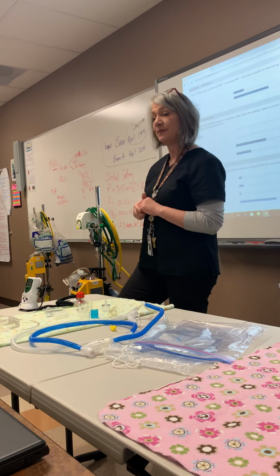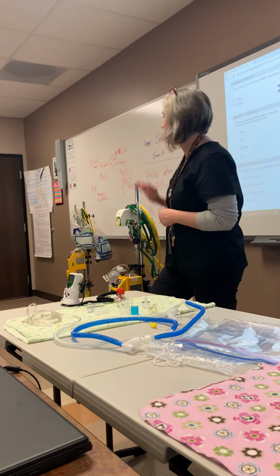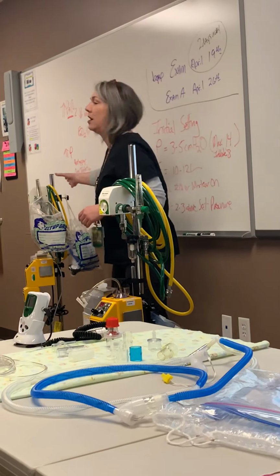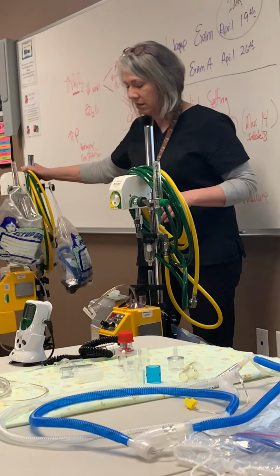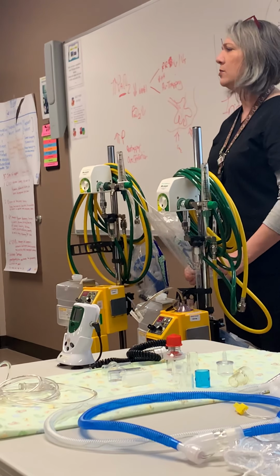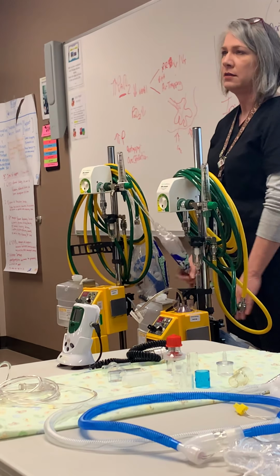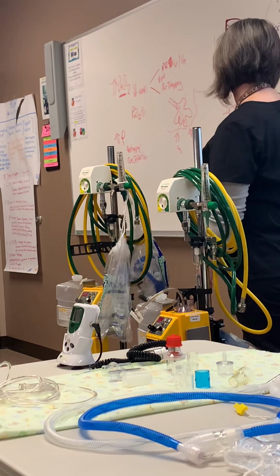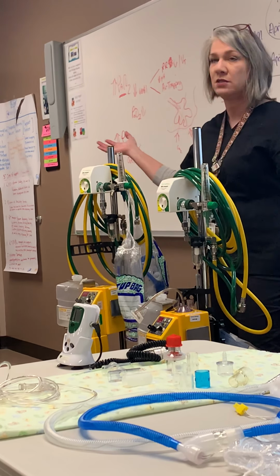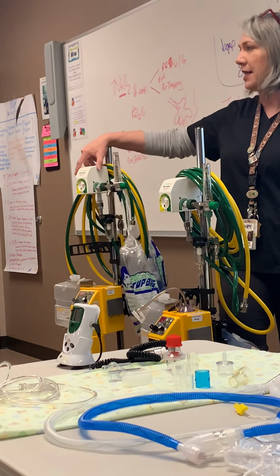All right. What's C? Heated humidification system. So on this particular stand stick pole, and this one too, you guys, these are both of our CPAPs that you'll be working with at the end of the term. Some of you asked me, do we have a practical final? We have a practical and a written. The written will be no different than this one, except more questions, because it encompasses all. But your practical is putting this little guy together.